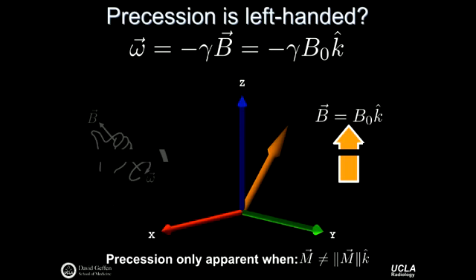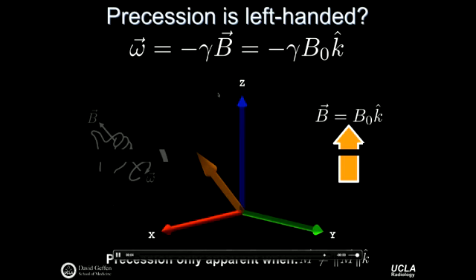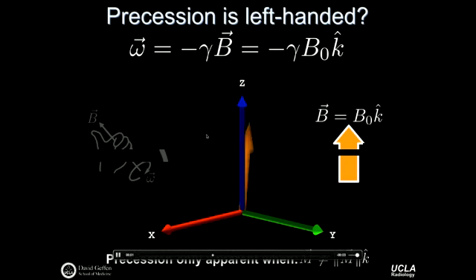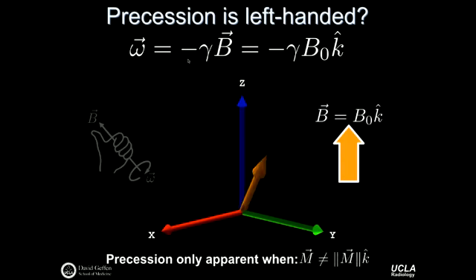One of the questions that we had, which I brought up in writing but we didn't talk about a lot, was the negative sign that shows up in the full form of the Larmor equation, or the vector expression of the Larmor equation. What this really boils down to is that we know observably that the bulk magnetization precesses in a left-handed manner for a positive B field.